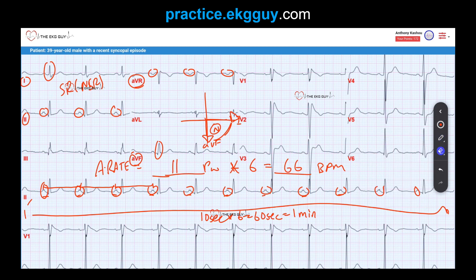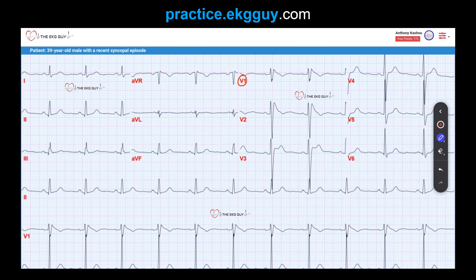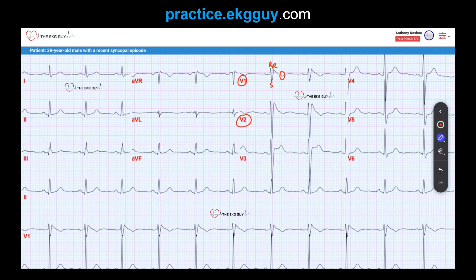Looking at V1 and V2, we see this RSR-prime pattern — a pseudo right bundle branch block pattern. The beta angle is wider. You see this ST segment that is essentially a coved downsloping segment, and it has inverted T waves. This pattern is consistent with a type 1 Brugada pattern.